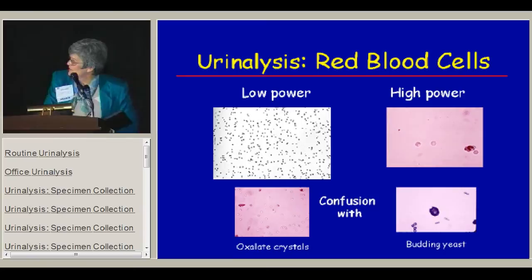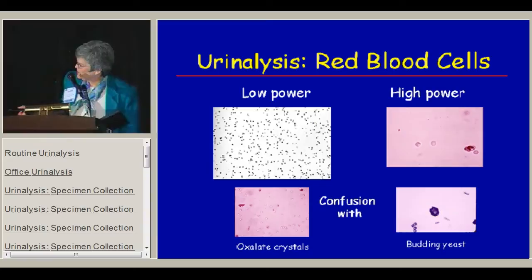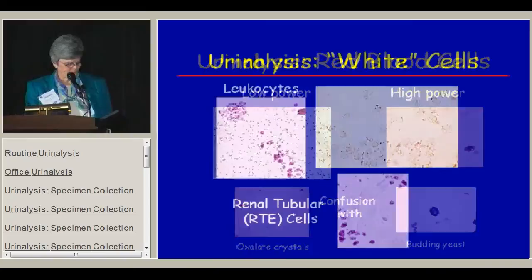Red blood cells can be confused with other things on slides. At low power, oxalate crystals might be mistaken for red cells, but if you look closely they have a cross in them and are actually double pyramids. Even yeast, especially budding yeast, can look like red cells — at high power a budding yeast can give that biconcave disc look of a red cell on its side.